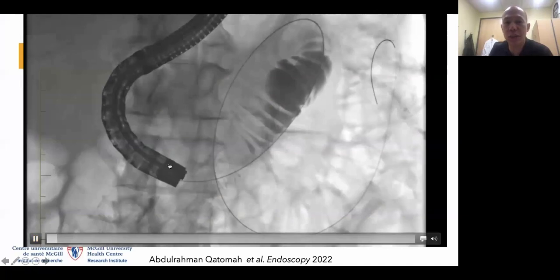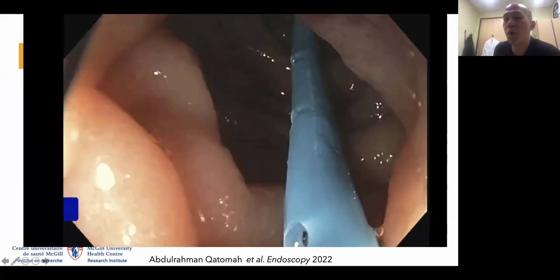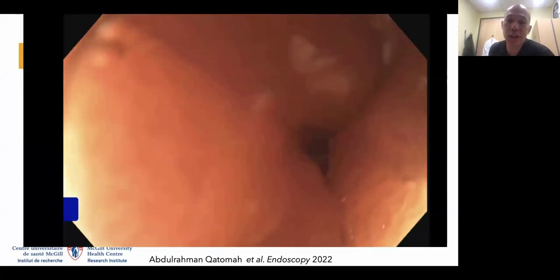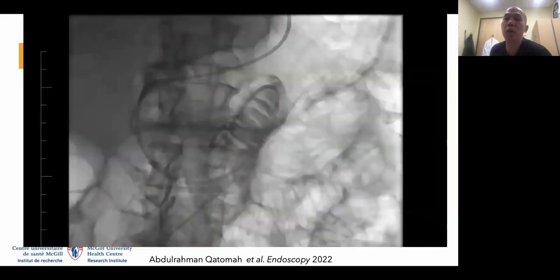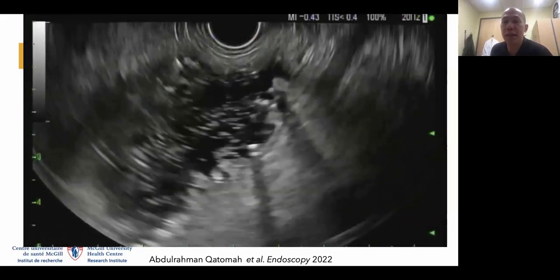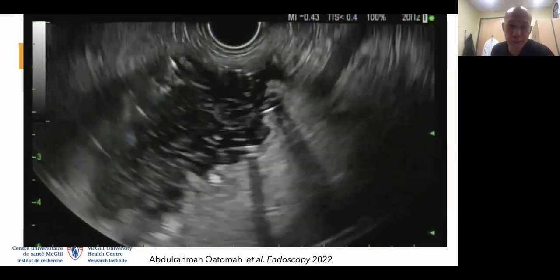Basically, this is the endoscope sitting on fluoroscopy, and we send a wire deep across the obstruction into the jejunum. Once the wire is there, we use a nasobiliary drain. Using a nasobiliary drain is nice because you can remove the endoscope and keep the drain there. And this drain is to infuse and pump fluid into the jejunum to really distend the jejunum for a target for stent insertion. So you can see here, this is a jejunal loop seen on EUS, and we're actively pumping fluid into it to really make it a large target.